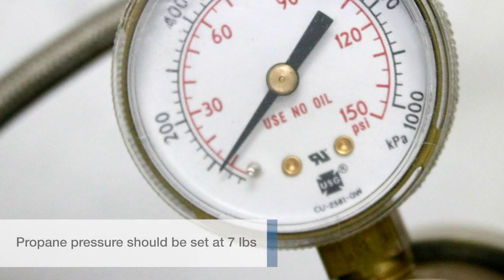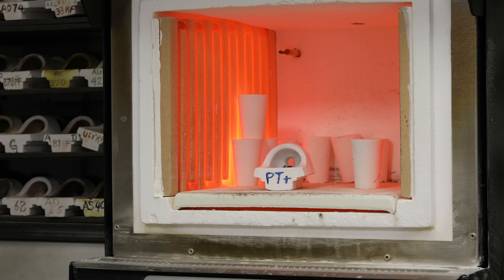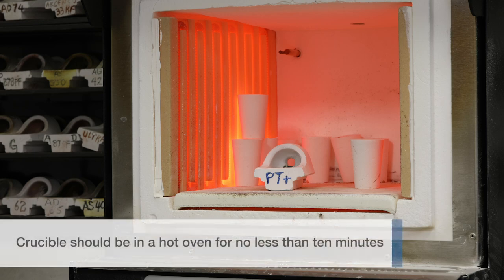Propane pressure should be set at 7 pounds and oxygen at 17 pounds. The crucible should be in a hot oven for no less than 10 minutes.